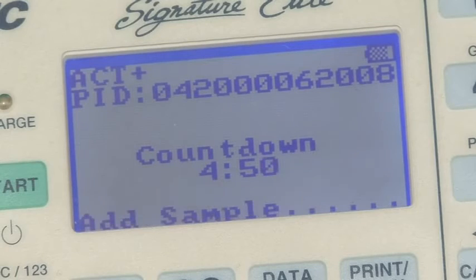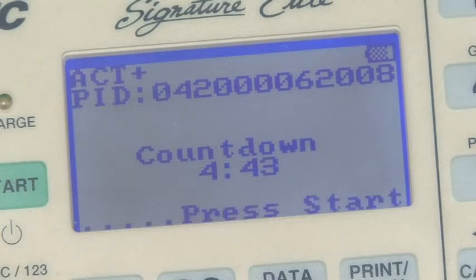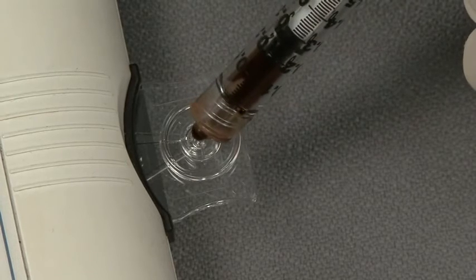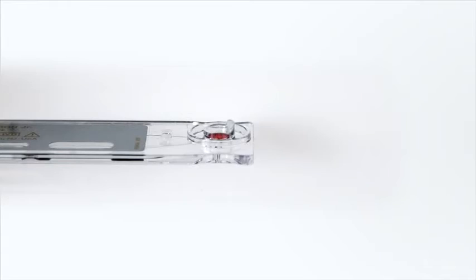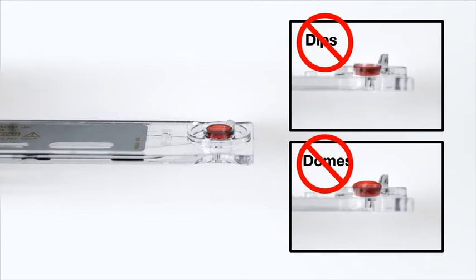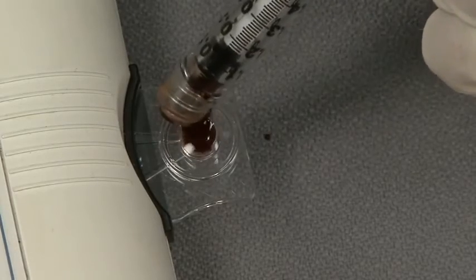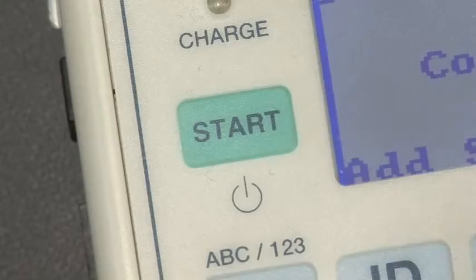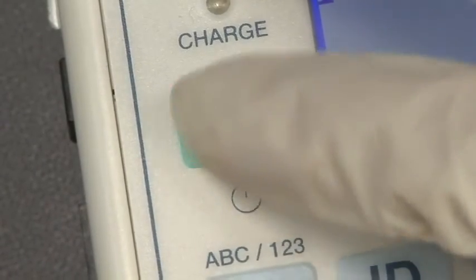Once the cuvette is warmed, Elite begins a countdown. You now have 5 minutes to take and apply your sample. When you have taken your sample, add a drop of blood to the sample well. Fill the sample well from the bottom up and add enough blood so that the lower wall of the sample well is completely filled. You need a level sample with no dips or domes. If any blood extends above the wall, push the excess into the overflow area. After you have added the sample, press Start.